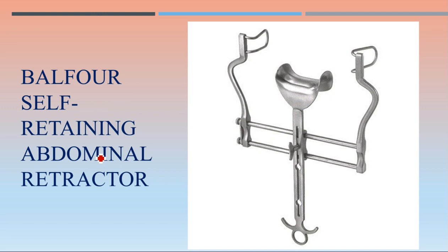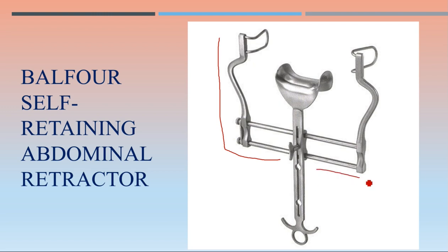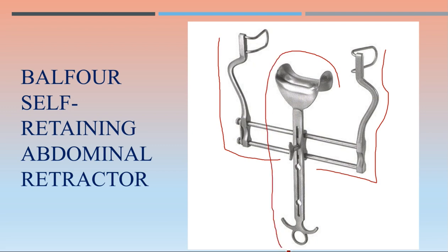This is the Balfour self-retaining abdominal retractor. Once applied, it self-retracts — it keeps things retracted without requiring continuous applied force, which is why it is called a self-retaining retractor. It has a body and a blade part. The blade is a separate part of the Balfour self-retaining abdominal retractor.